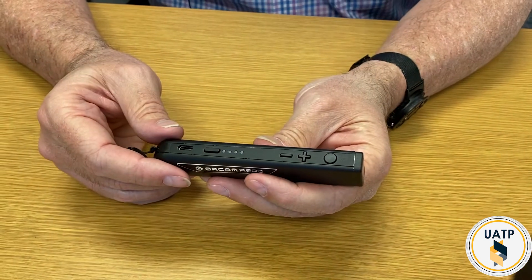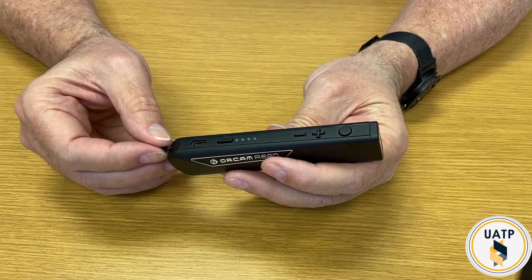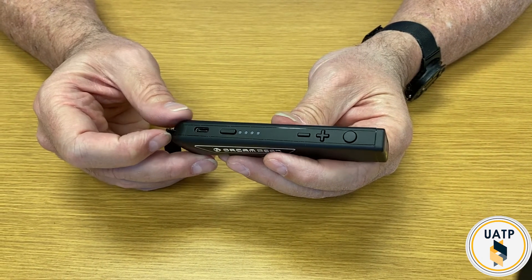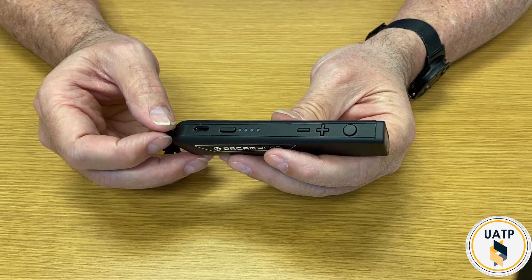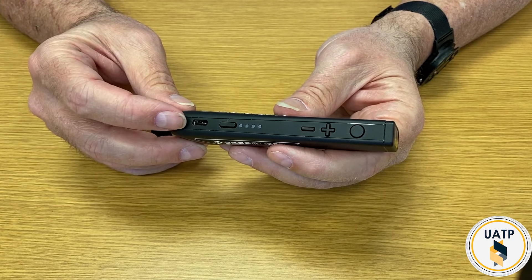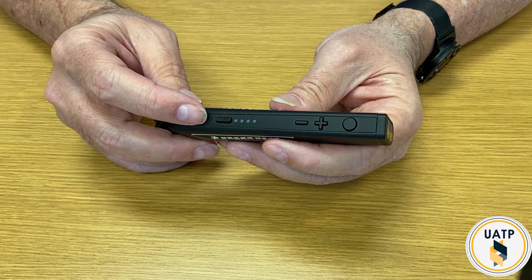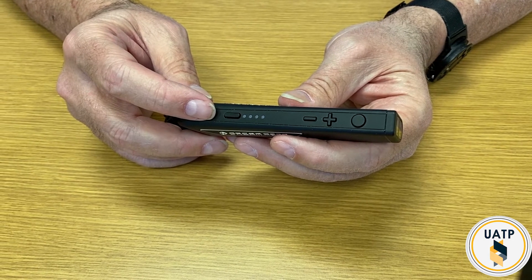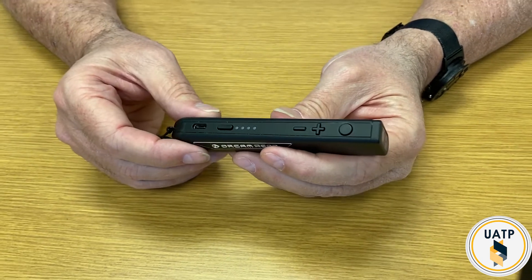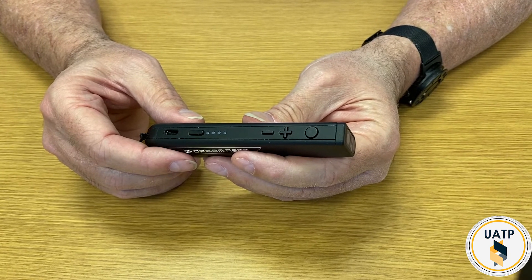Notice it does not require any internet connection. There's a lady who has a job in a place that doesn't let you use internet. It will connect to your wireless network if you want — this one connects to mine at home — but only when plugged into an electrical outlet. All it's doing is watching for software updates. If you unplug it, it'll immediately disconnect. It doesn't send any data; anything you take a picture of doesn't go anywhere. Software updates are free.